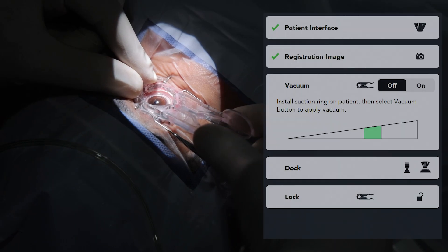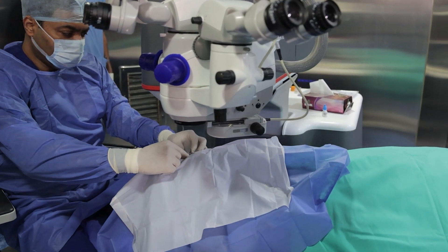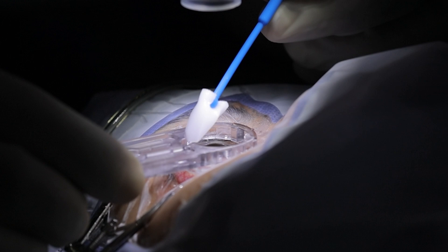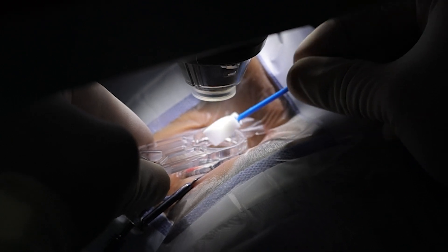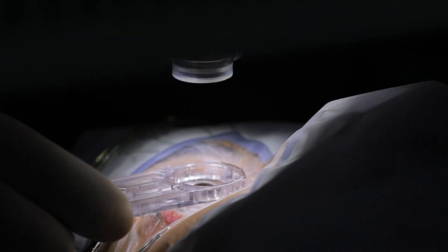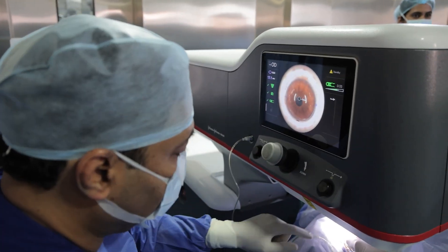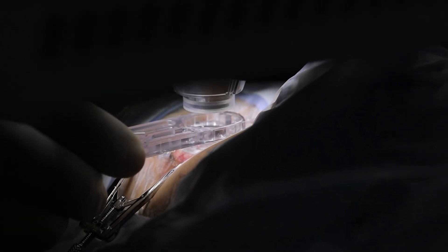This looks very good. So I ask to press the vacuum — suction on — and then the vacuum is achieved. Now I hold gently and move the bed to the area where the laser will be fired. Sometimes at this point, if I see a lot of dry spots, I use the sponge with a little bit of fluid so there are no dry spots. During this procedure, I gently bring down the patient interface cone. I'm looking at this image here, also looking at where my hand is holding the suction ring, making sure my hands are steady, not tilted, and in parallel.